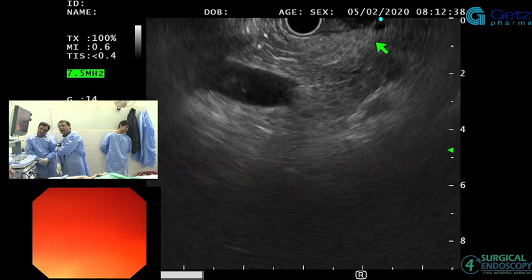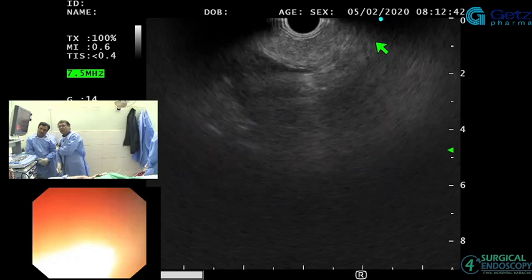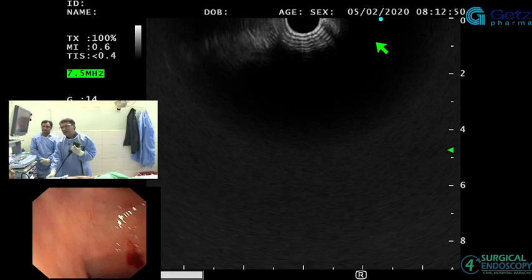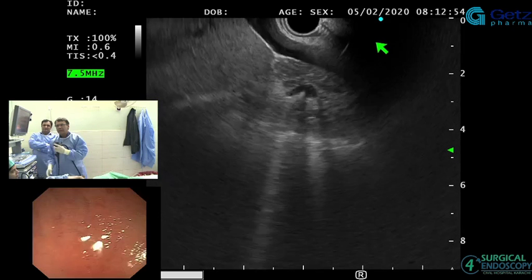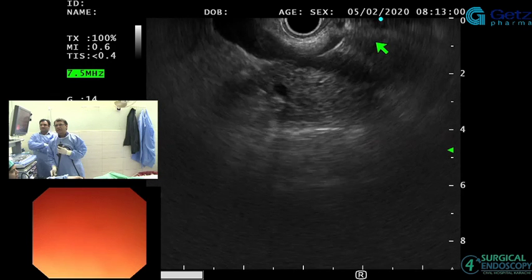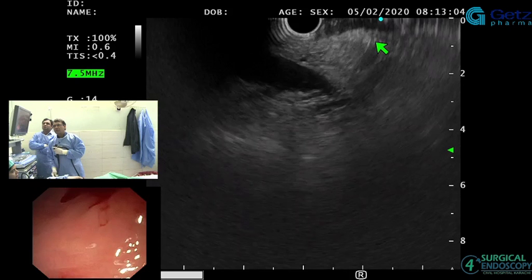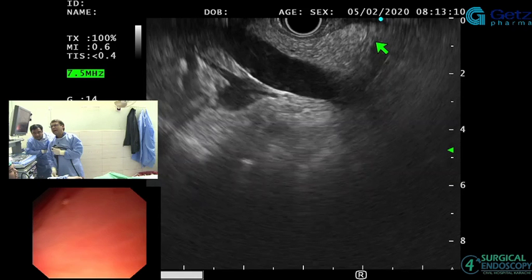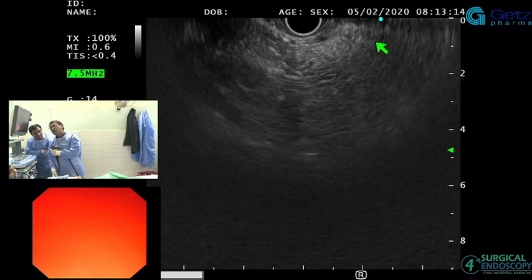It's also a little bit shorter in that place because of the surgery, but there's nothing in the uncinate process or in the head area. So nothing there, endoscopically all looks good. Every time I use EUS, I make a habit, train your brain that you're not supposed to be putting your finger on the air button. Okay, audio up, but let's do the mediastinum area.